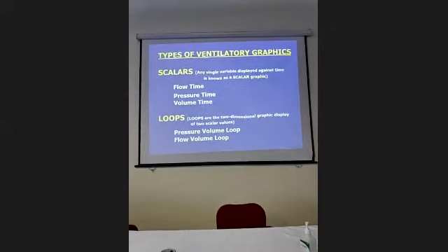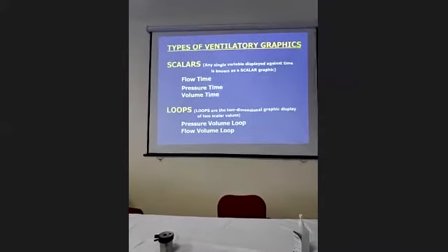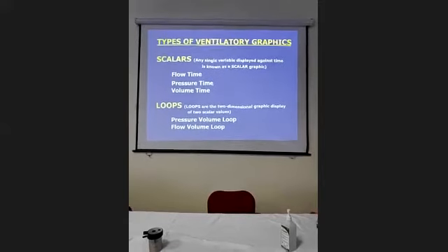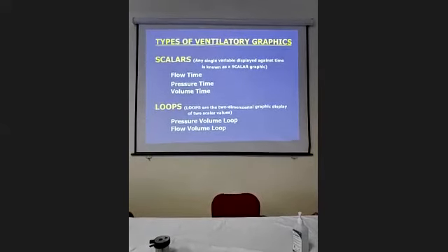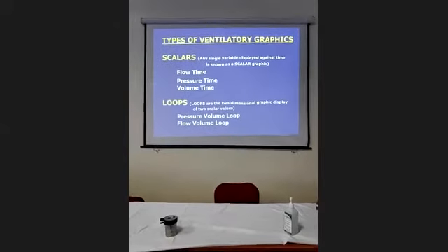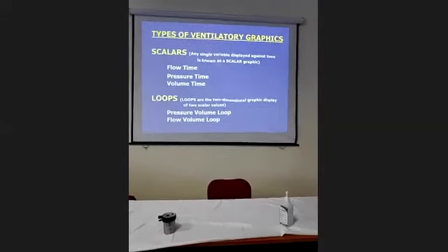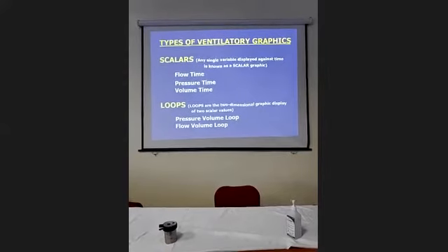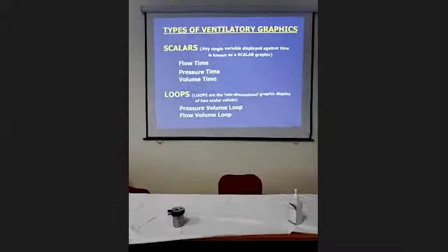Now, as I said, these graphics you have to understand, because this is very important. Unless you understand the graphics, you are playing a blind game. You don't know what you are doing. Another thing I want to say is that whenever you purchase a ventilator, it must have a proper graphical display on it. If it does not have a proper graphical display, I will always say don't purchase that ventilator. It is useless. You will never come to know whether your patient is getting a benefit out of that or is getting harm. So, along with the ventilator, a proper graphical display is an important requirement when you purchase it, and as I said, arterial blood gas measurement. So ABG measurement is also very important.